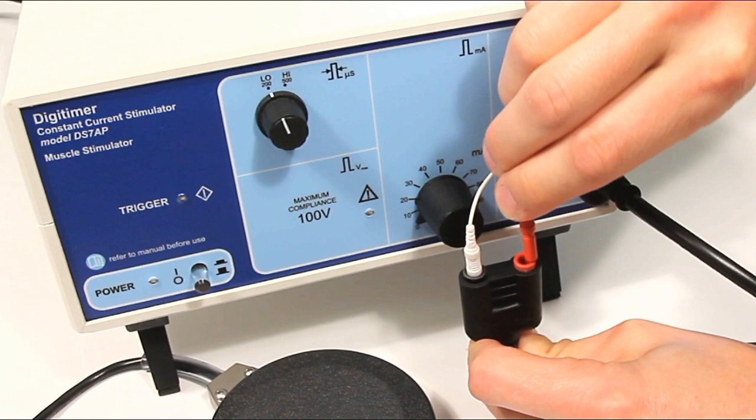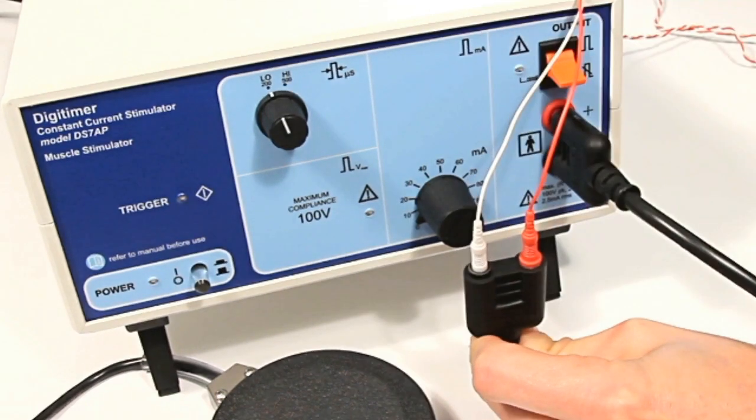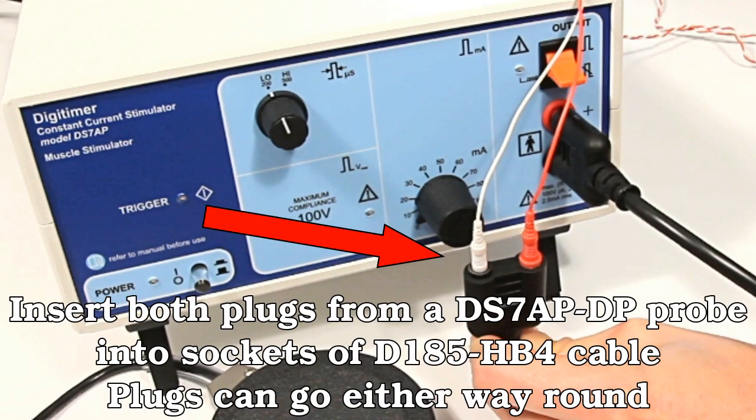Next, connect both of the 1.5mm plugs fitted to the disposable probe into the sockets at the other end of the D185HB4 electrode connection cable. Once again ensure they are fully inserted. Note that either plug may be connected to either socket as the connection orientation does not matter.